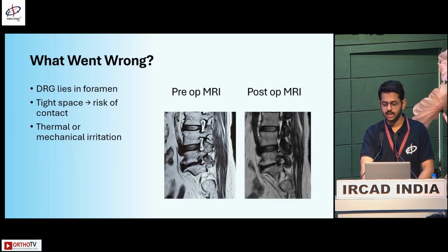The L5 DRG lies in the foramen, and in collapsed spaces it is extremely close to your working zone. Any minor contact, mechanical from an instrument or thermal from the RF or bipolar, can trigger irritation. This was likely the reason for her symptoms.